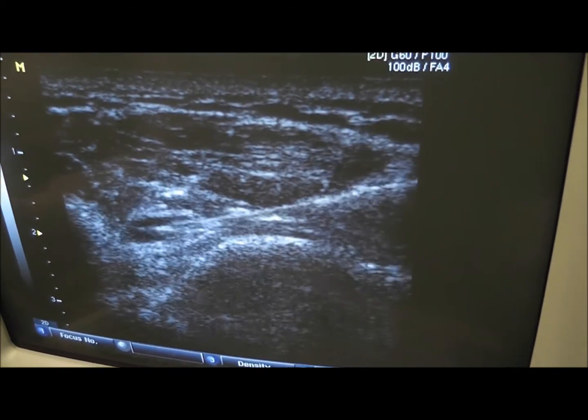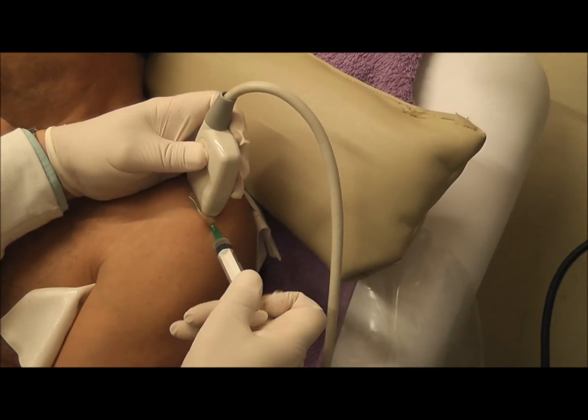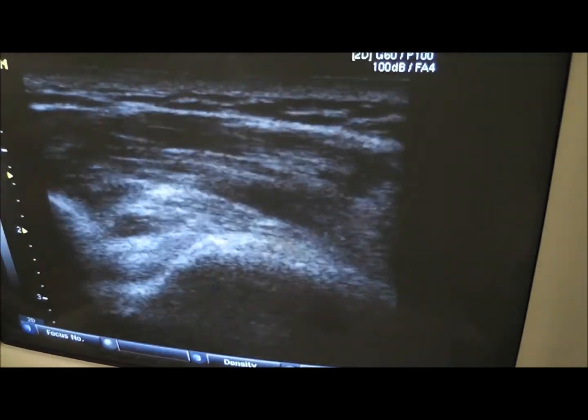The patient has no pain because of the previous local anesthetic. End of the procedure.